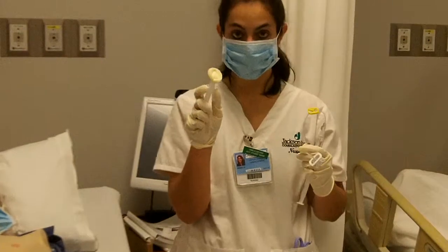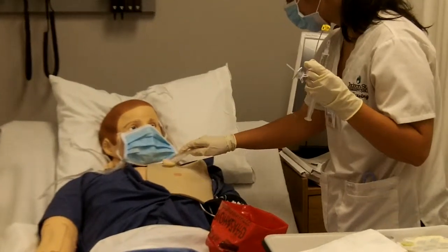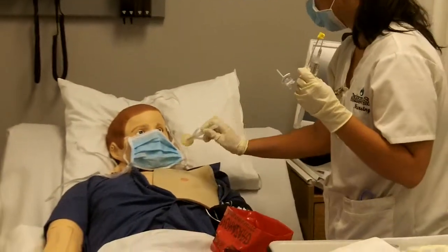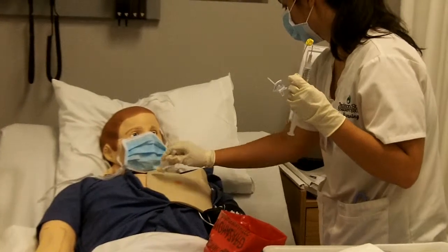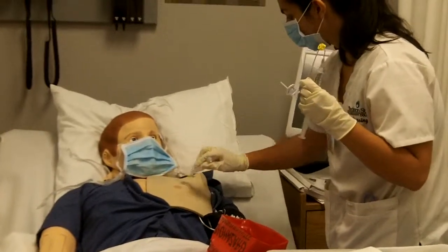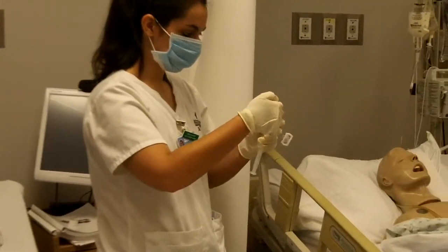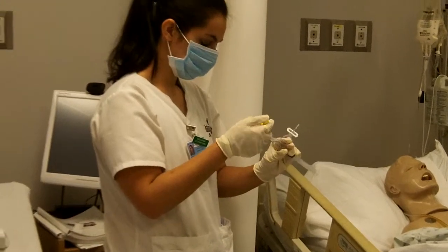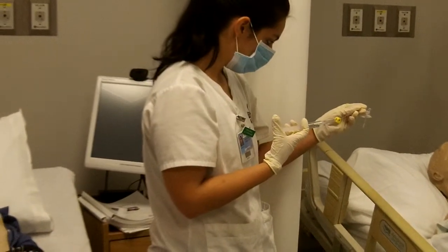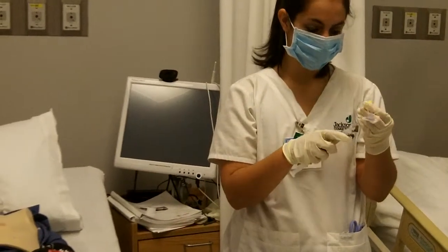And I pop the wings of my chlorhexidine wipe. And I do this for 60 to 90 seconds. Side to side, up and down. Okay. And while that's drying, I'm going to prime my Huber needle. Okay. Reclamp it.